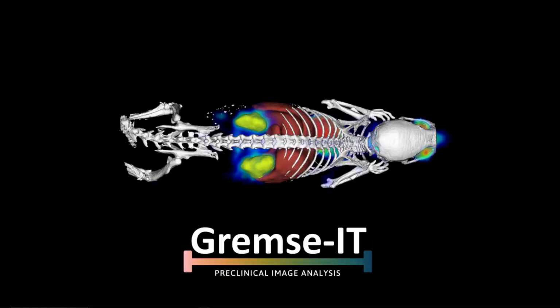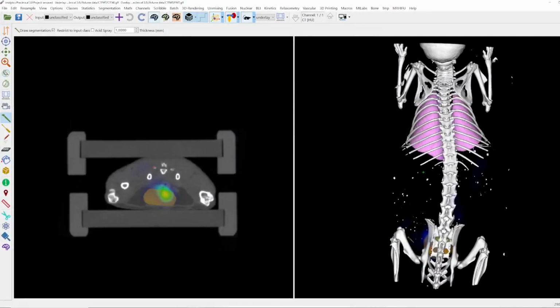Hello! In this video I would like to focus on the input and output class. Let me open the Imalytics Preclinical first. We have here a CT-FMT dataset where the lungs and the bladder were already segmented. By default, when you open the software, the input and output class are set as unclassified.